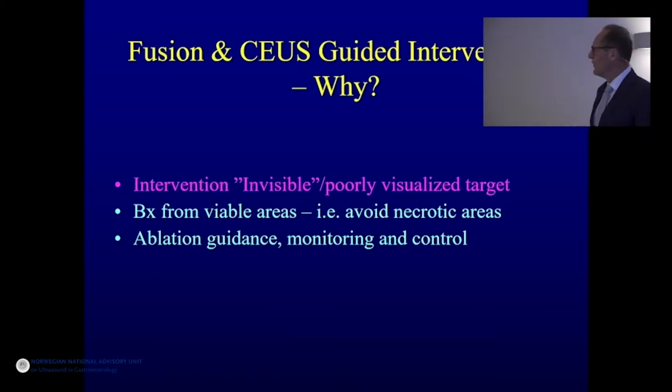What can we use it for? Well, sometimes we have so-called invisible or maybe just not very conspicuous lesions that we get referred to ultrasound. Can you please take a biopsy, or can you please do an ablation? But you don't see it in ultrasound, or you see it vaguely. It's not really visualized. What do you do? Well, you could try using fusion and CEUS.